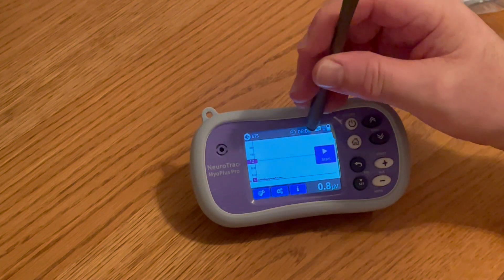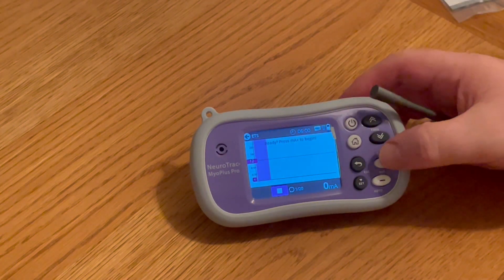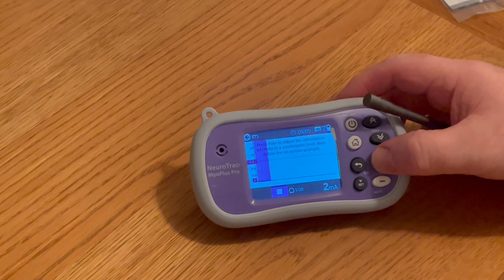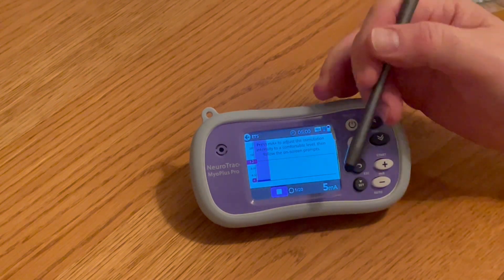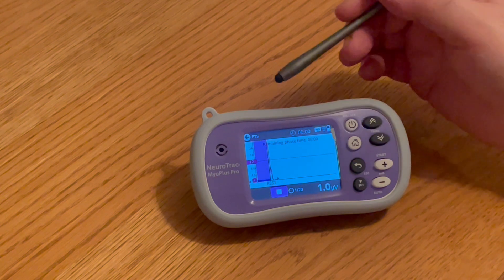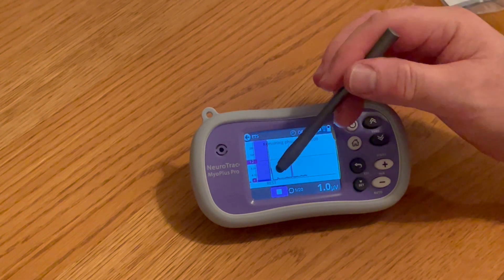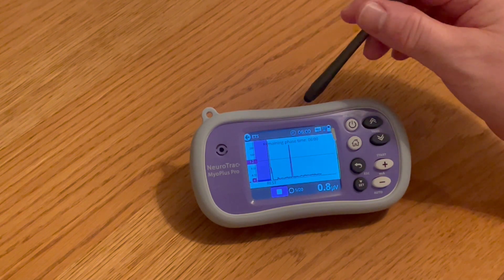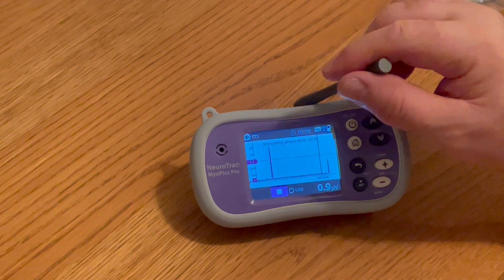When we're happy we can press start. The only way we can actually start is that we must press this button to increase the stimulation to something that is comfortable but strong for the patient, otherwise the device doesn't start its work/rest cycle. Here it's in a rest period and it will then soon come up and say work, and that is when your patient is told to contract.